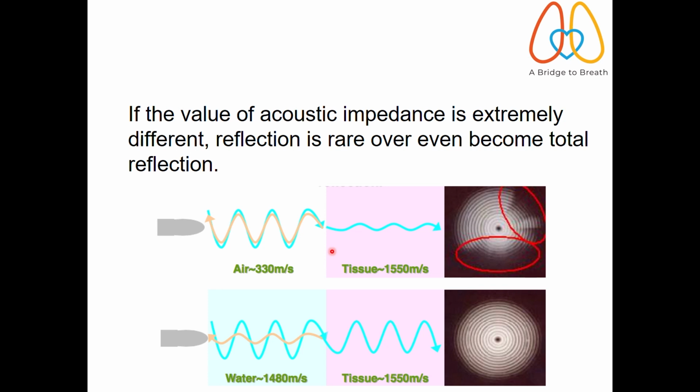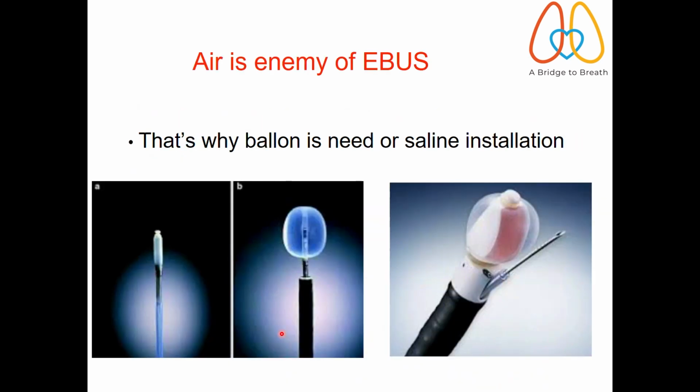Okay. So when one sound wave transmits to another, and both the media have a different density, what happens is it transmits back. So when you go to an auditorium or somewhere, you have most of the panels which absorb the echo, otherwise it reflects back. So when the air is touching another medium, most of it is going to reflect, and if they have the same density, most of the wave passes through, and the reflection is lesser.